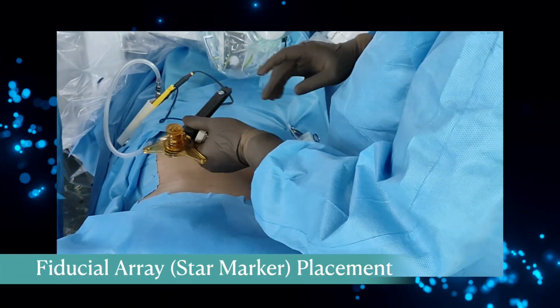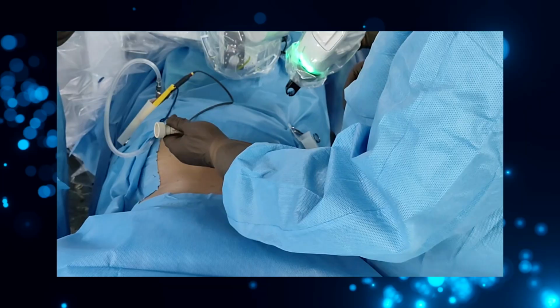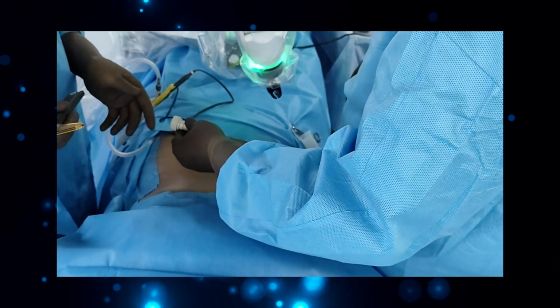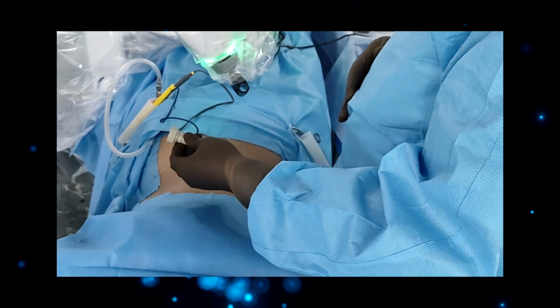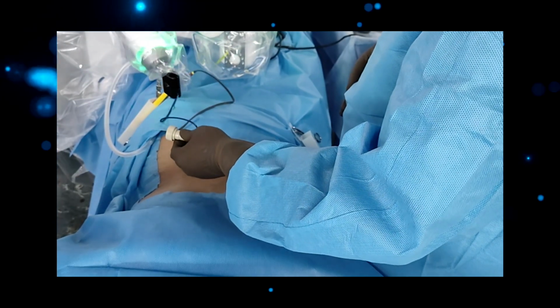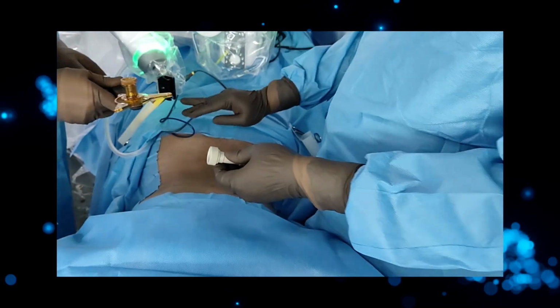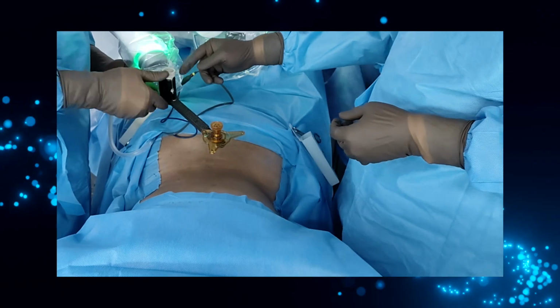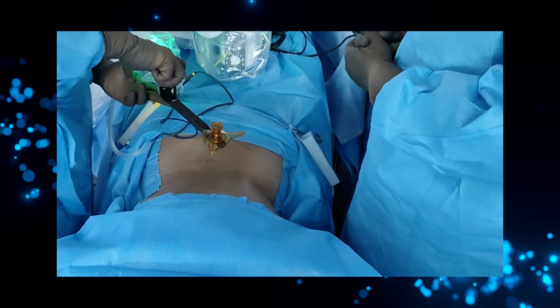The robotic arm then assumes a position to attach a fiducial array, also known as a star marker. This marker contains radiopaque beads, which are essential for intraoperative image registration. By overlapping these beads with the patient's anatomy in the intraoperative CT scan, the robot gains a precise understanding of the patient's anatomy relative to its own position.